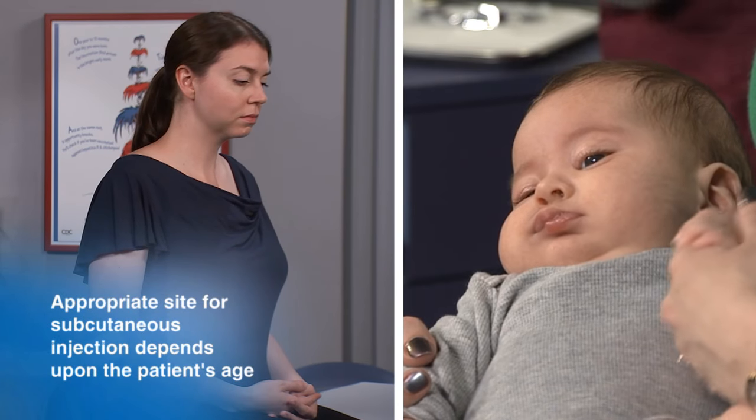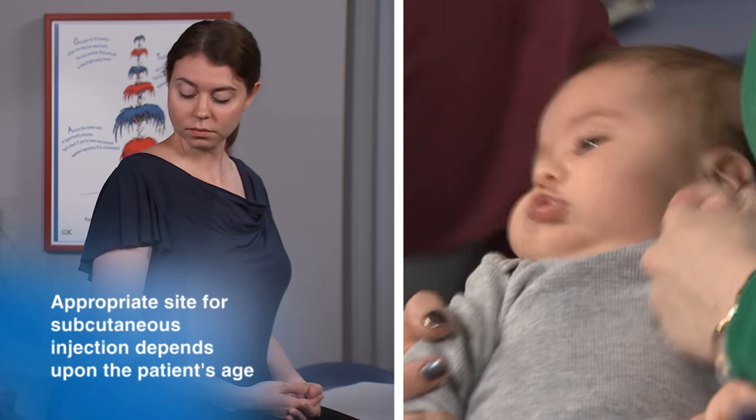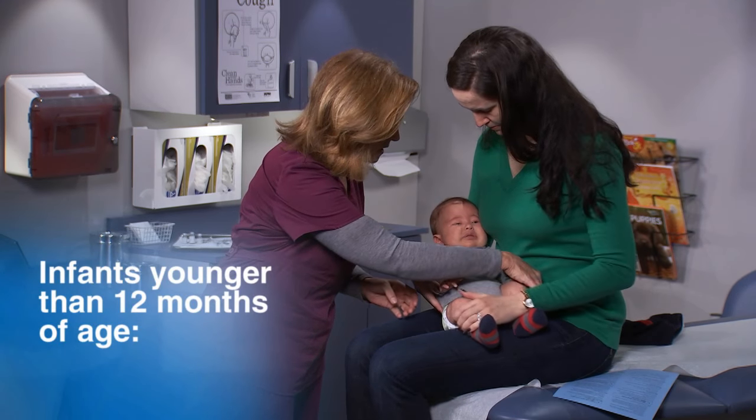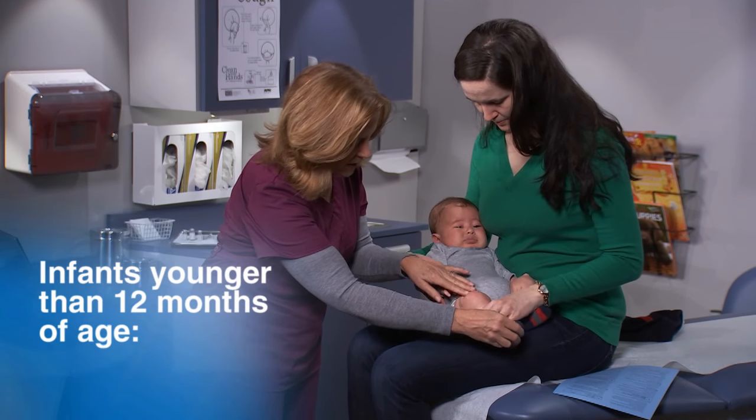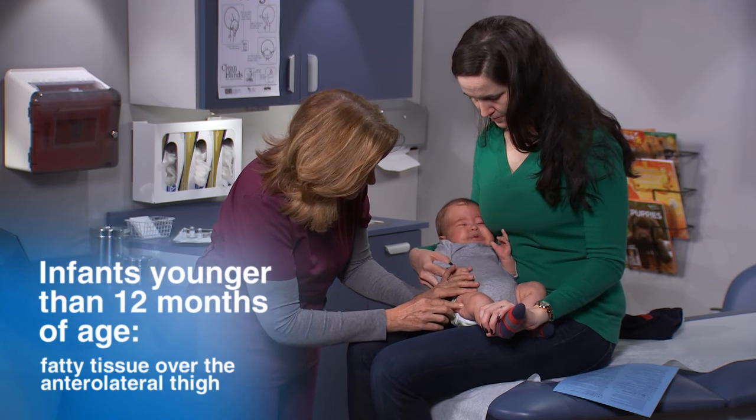The appropriate site for a subcutaneous injection depends upon the patient's age. For infants younger than 12 months, the recommended subcutaneous site is the fatty tissue over the anterolateral thigh.